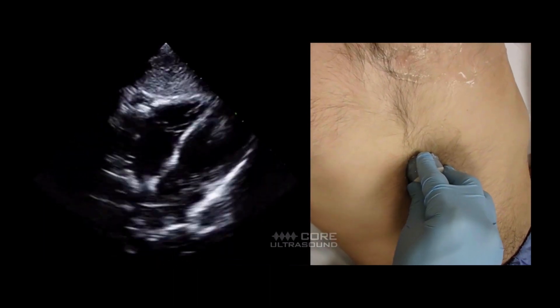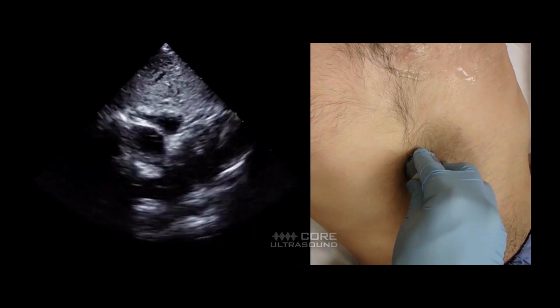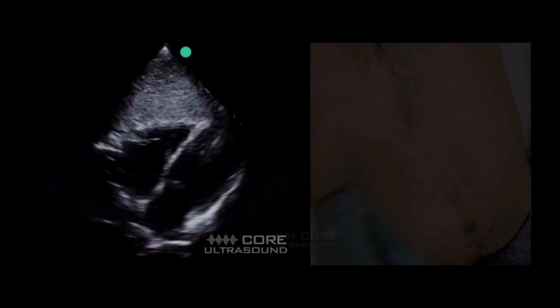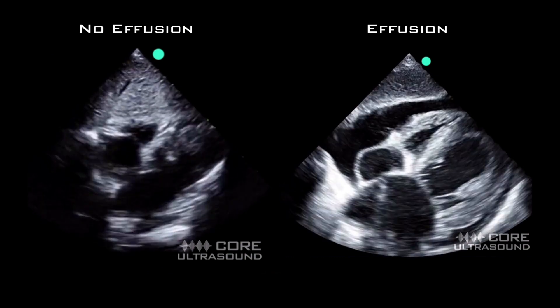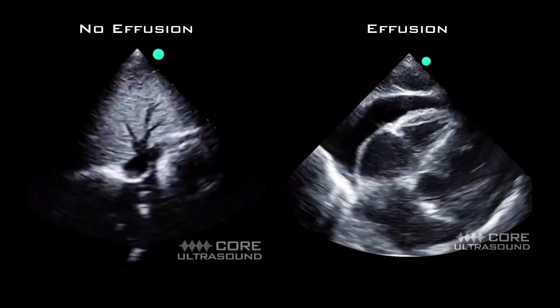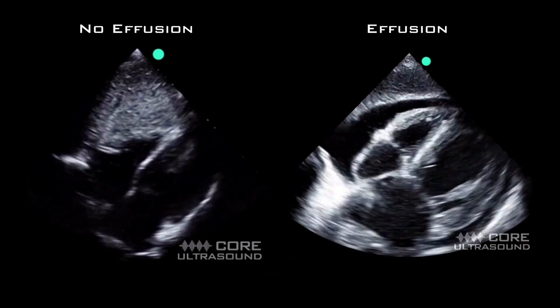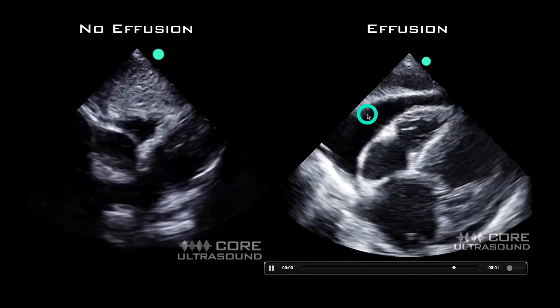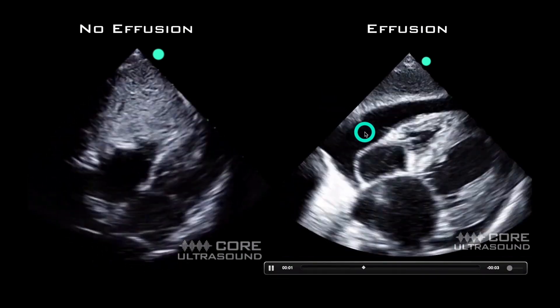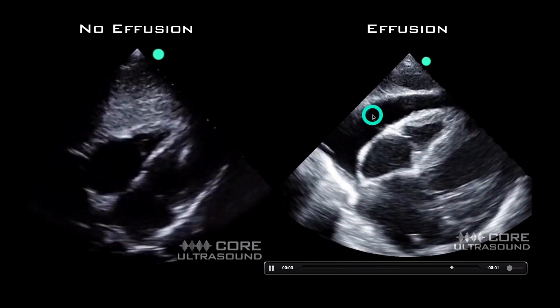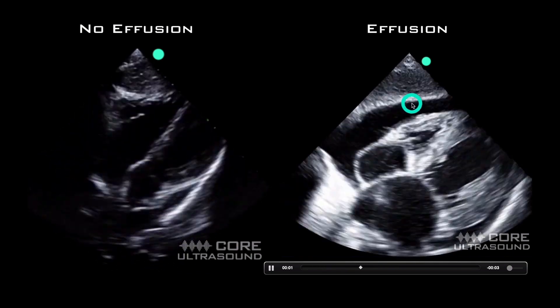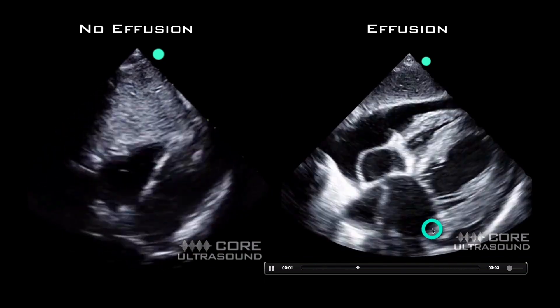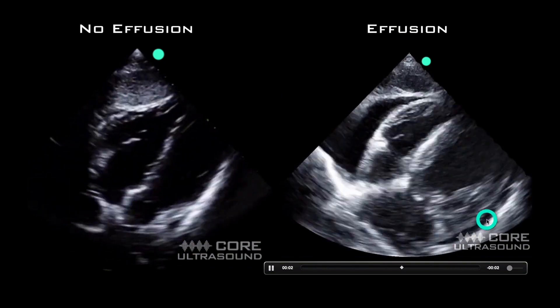If you're unfamiliar with this view, I'd recommend checking out the obtaining cardiac windows 5 Minutes Sono video. On the left side we see a sub-xiphoid view without a significant pericardial effusion, and on the right side we see a pericardial effusion. Remember, fluid is hypoechoic or dark on ultrasound — we're seeing on the right side a good-sized pericardial effusion, with the right heart and the left heart visible, and even a little sliver of it down here.